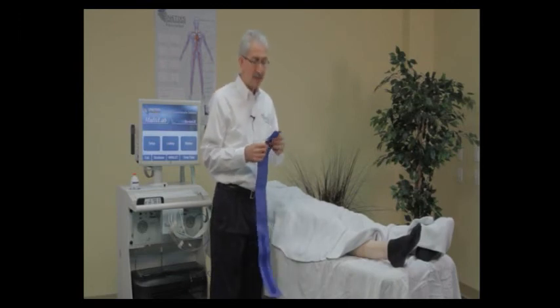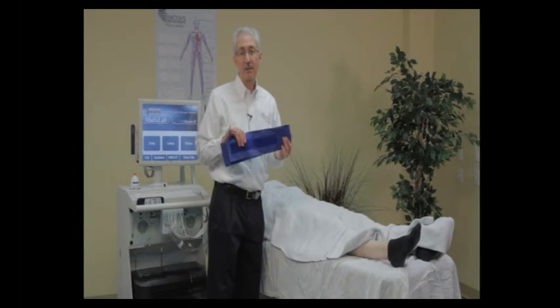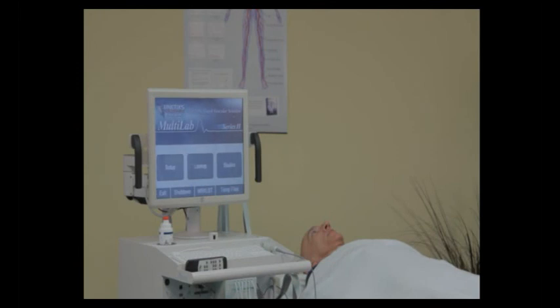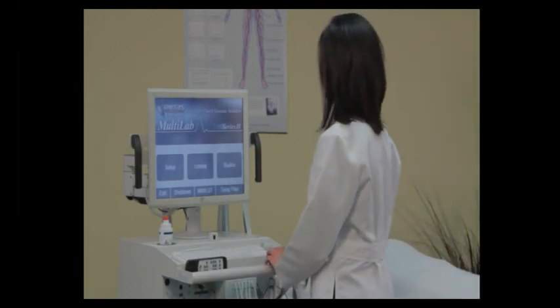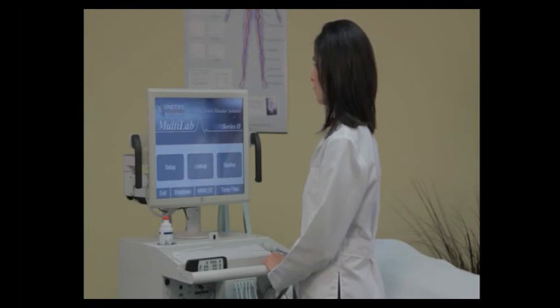None of the cuff sizes I've detailed have any latex in them at all. In this next portion of the video, we're going to be showing how to perform a segmental pressure study with PVR waveforms. PVR stands for Pulse Volume Recording.